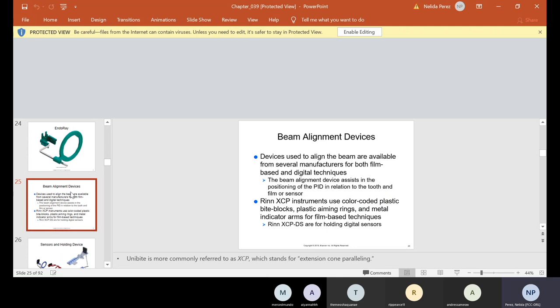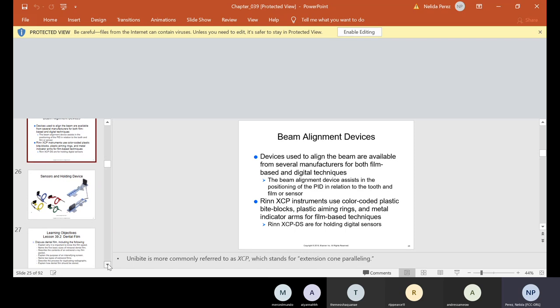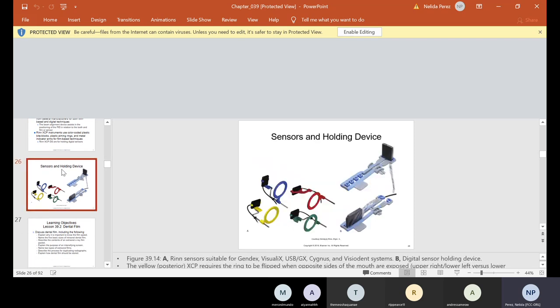Beam alignment devices are used to align the beam and are available from several manufacturers for both film-based and digital techniques. The beam alignment devices assist in positioning the PID in relation to the tooth and film or sensor. Rinn XCP instruments use color-coded plastic bite blocks, plastic aiming rings, and metal indicator arms for film-based techniques. The Rinn XCP DS instruments are for holding digital sensors. I have both — I need you to practice both. Here are some different sensors and holding devices.